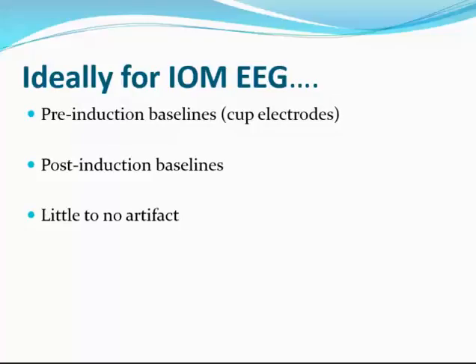I know this may not be in widespread use in many laboratories and clinics, but the honest truth is it is necessary to do, because it is possible that the patient can stroke while going to the OR or while they're in the OR prior to induction. So you want to be able to assess where they are.